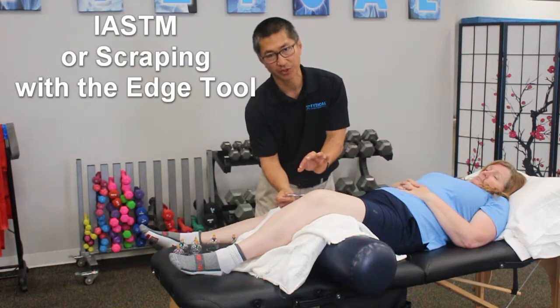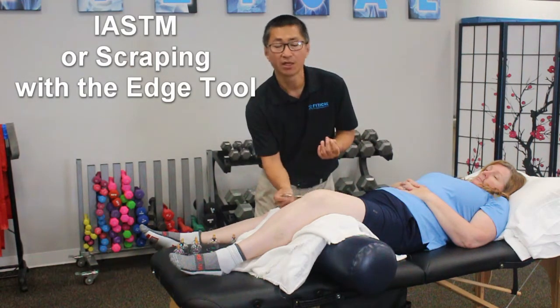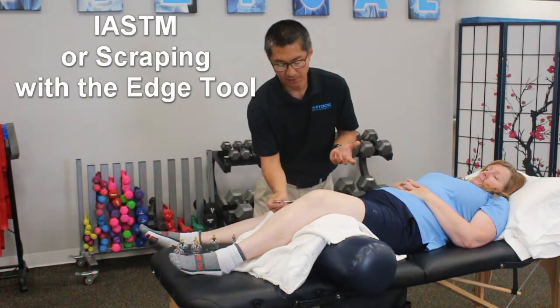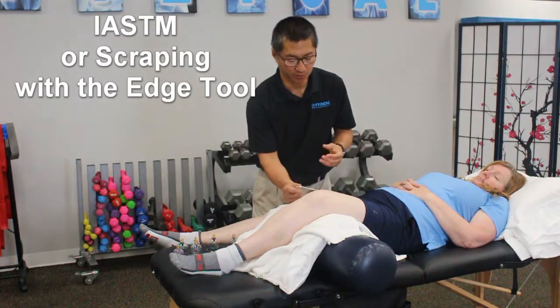Just a little bit of cream, we don't want too much, because the tool actually gives us feedback in terms of what the tissue quality is like. And we're going to focus on some of the areas that we're going to treat for around 4 to 5 minutes, just to get, one, the fascial tissue nice and loose, two, encourage some circulation going there, and hopefully this will feel nice and comfortable for Kathie as well.